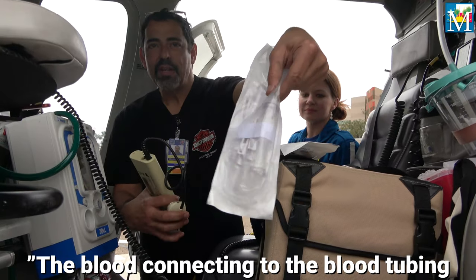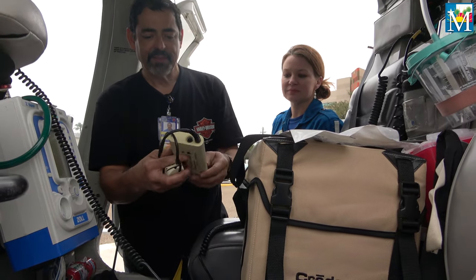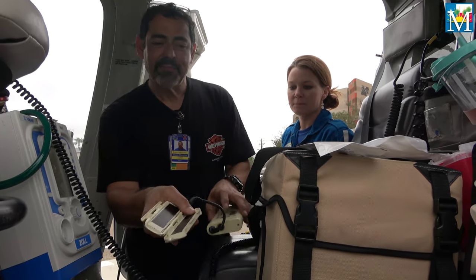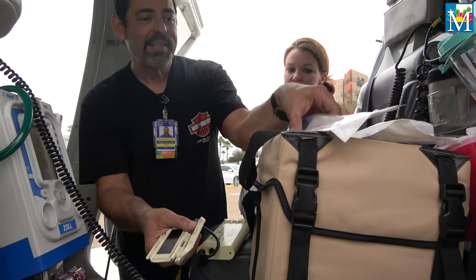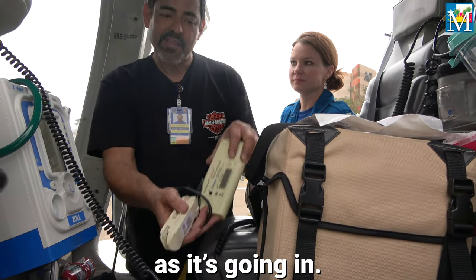The blood connecting to the blood tubing, and then at the end of that goes this little cartridge. I can open it up right here. This little cartridge right here has these two ceramic devices right here that actually heat. This thing right here will go right inside of here, and it heats it instantaneously as it's going in.